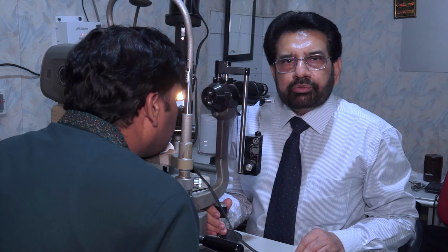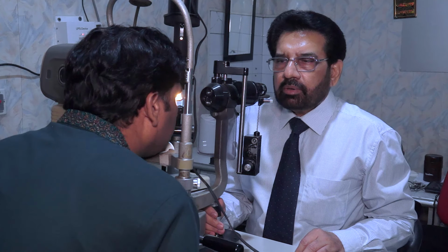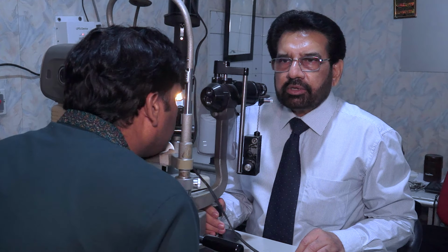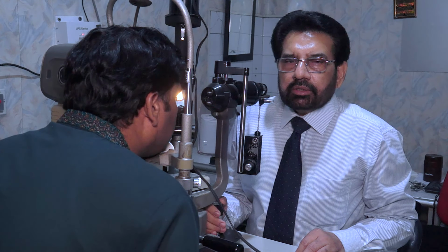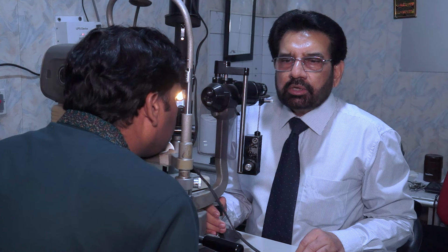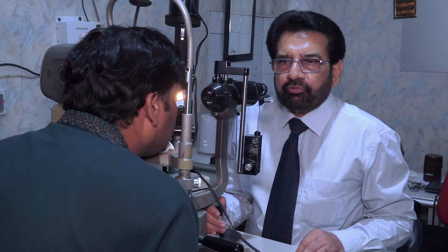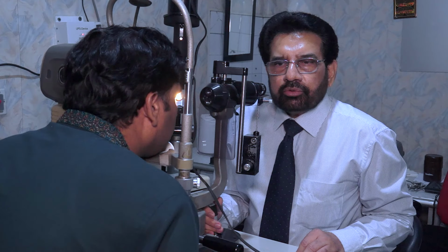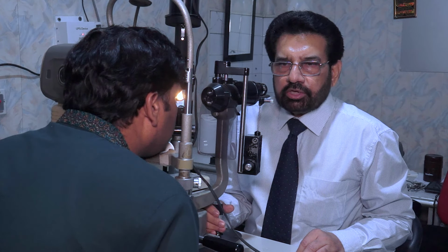We are going to examine the patient on the slit lamp and how we examine it. That is the purpose of this video. This is the most common procedure which we perform on the patient for diagnosis of any disease. This is called a slit lamp examination.